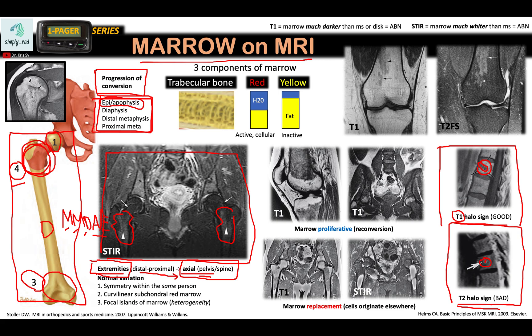The last thing to discuss is normal variation. There is some variation from person to person, but within the same person there should be symmetry. So if you have an abnormality on one side, check if it is present on the other side — if it is, it might just be normal variation. Number two: there is curvilinear subchondral red marrow present even in adults. In this T1-weighted image, there is a little bit of red marrow in the subchondral region — not to be mistaken as abnormal marrow or avascular necrosis.